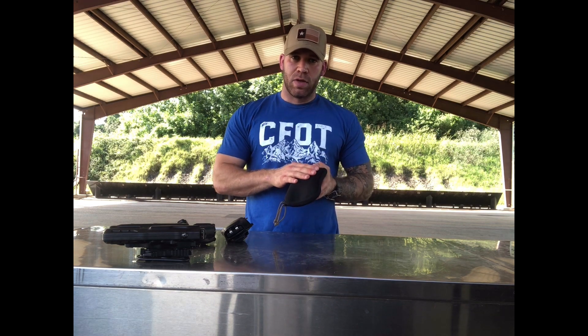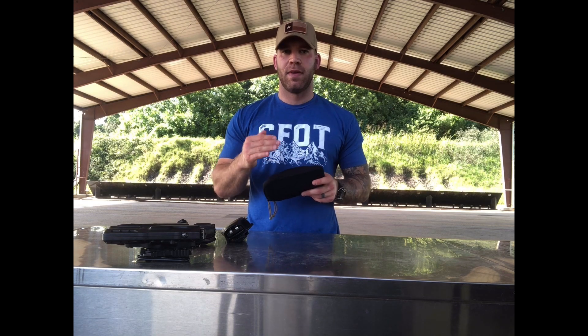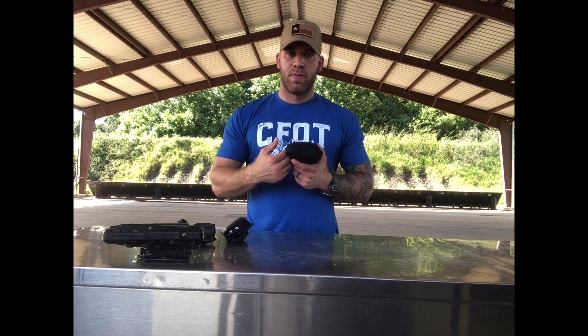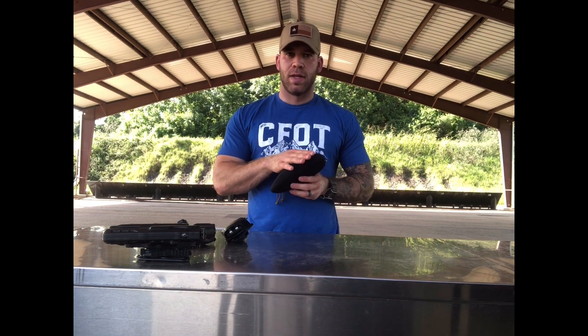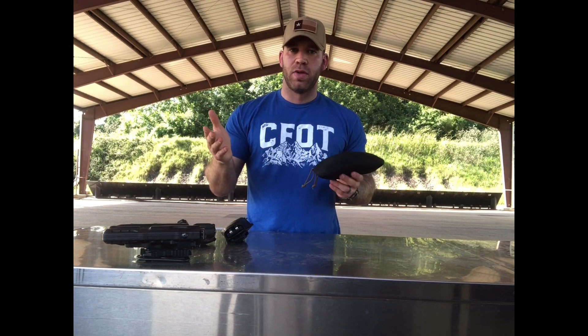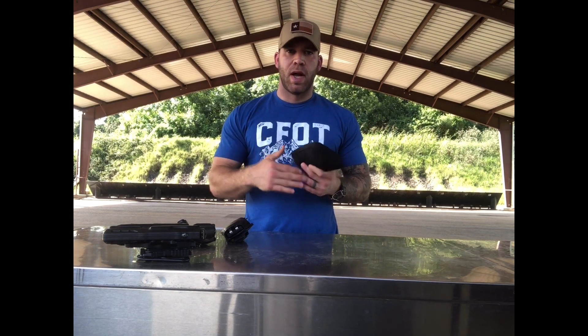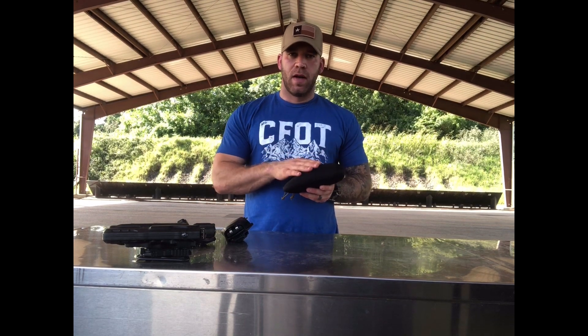The reason I like this kit so much and I'm using it as my model is because it has everything that's necessary to have in an IFAC and nothing more. I'm reviewing this from the perspective of a police officer, so I don't need things in here that I'm not qualified to use. Everything in here a police officer or a citizen can use with very minimal training — it takes repetition but not extensive training to know how to do these things.